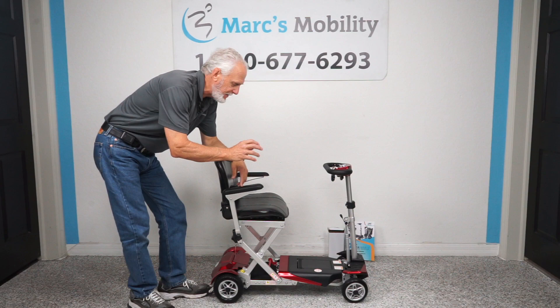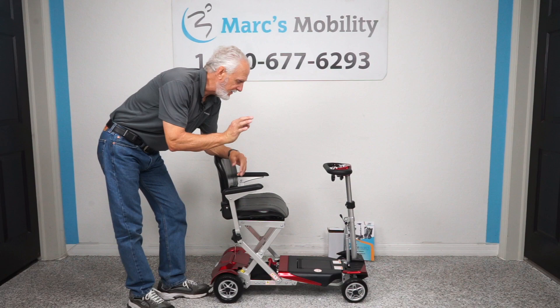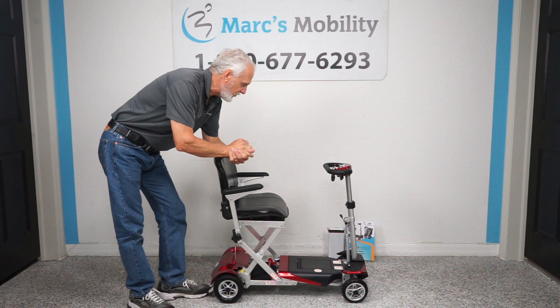Top speed on this scooter is about 3.7 to 3.8 miles an hour. Top distance on a battery charge is up to 13 and a half miles on a battery charge.